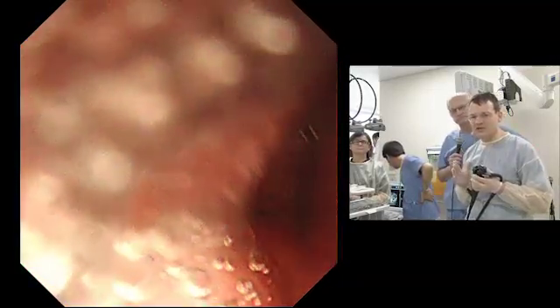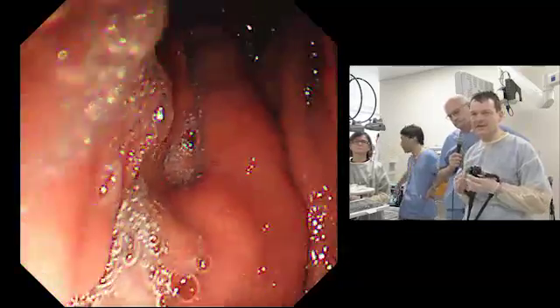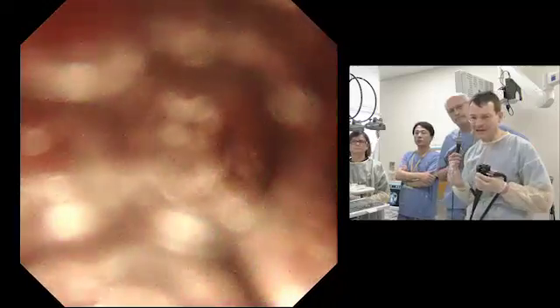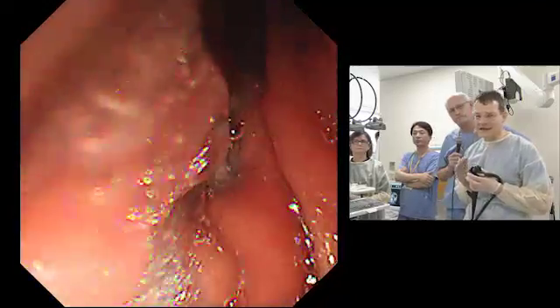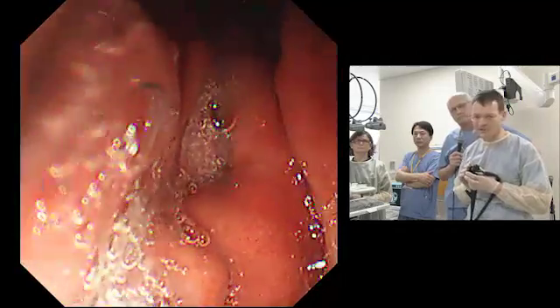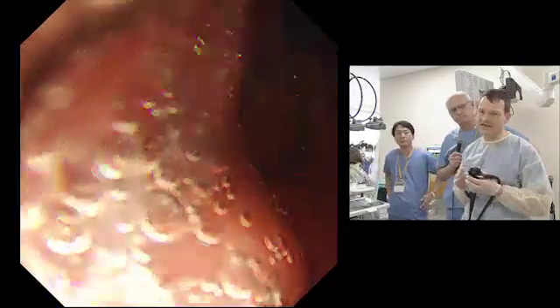He does not have very many symptoms. He had a little bit of back pain, and from the laboratory results, he has no elevation of the lipase. The CA 19-9 is a little bit elevated, but he has a lesion in the pancreatic corpus. And now our task is to show you this lesion first and then to describe what we should do, what we see, and if we perform an EUS-FNA.